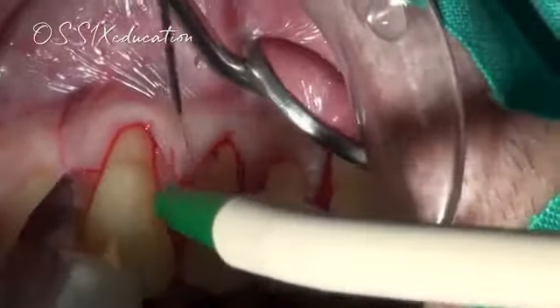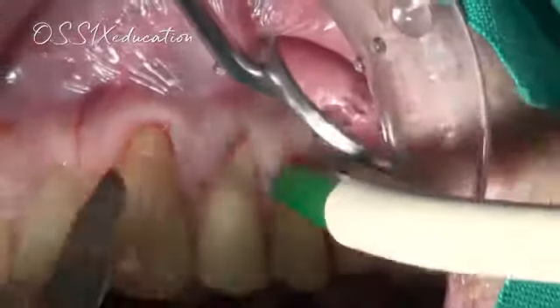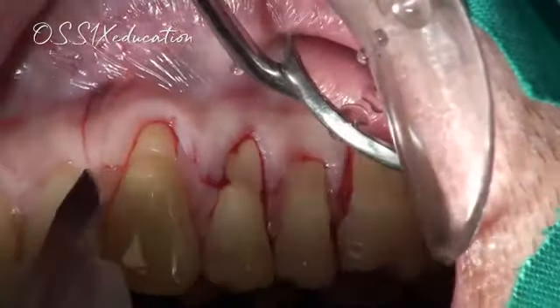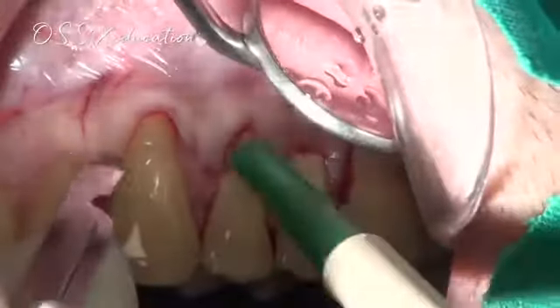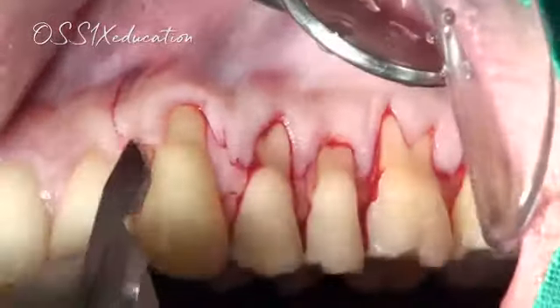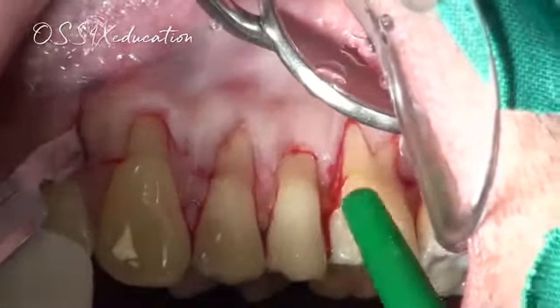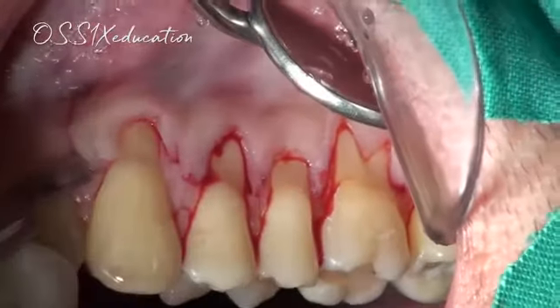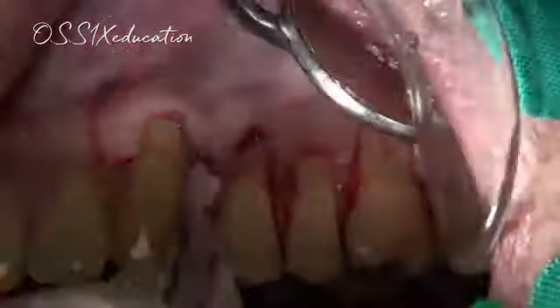So you can see that the incisions are going from the canine to the first premolar, and then from the first premolar in another direction, in an oblique way, to the second premolar, and like that up to the first molar. Here we're doing a split thickness flap. All the incisions are first split thickness, and then we will raise the flap into full thickness until the level of the bone.